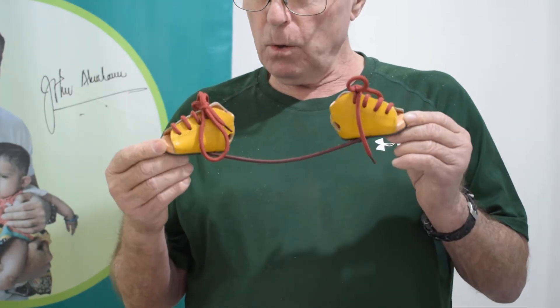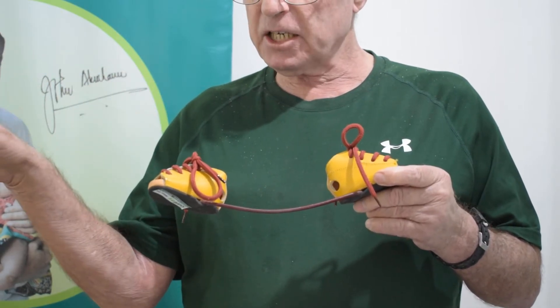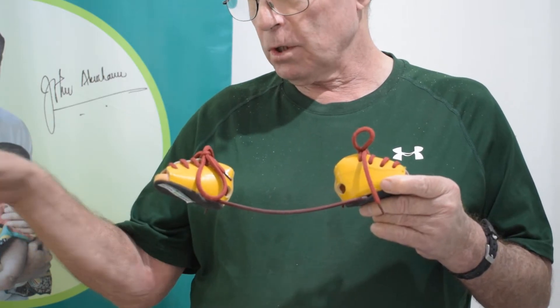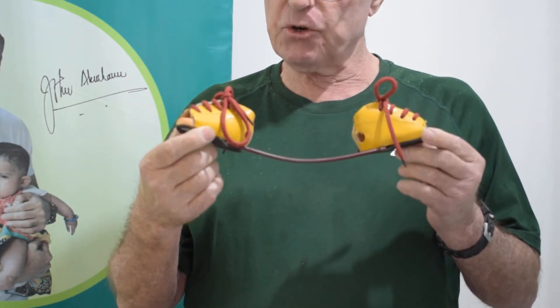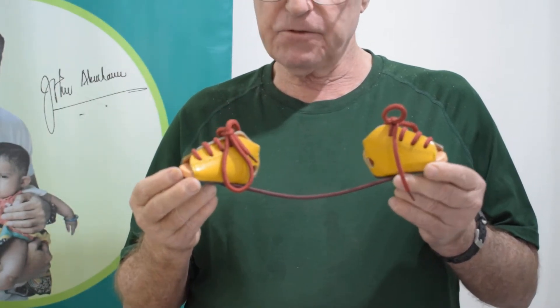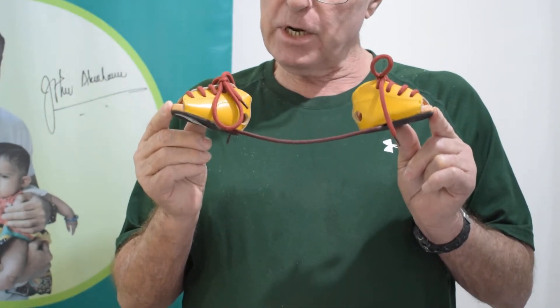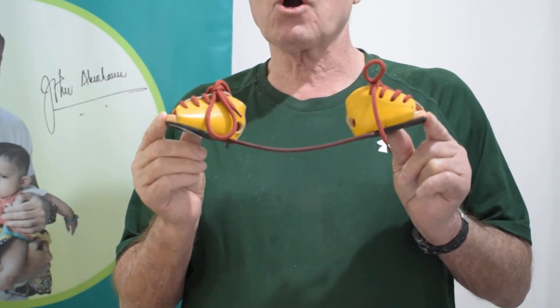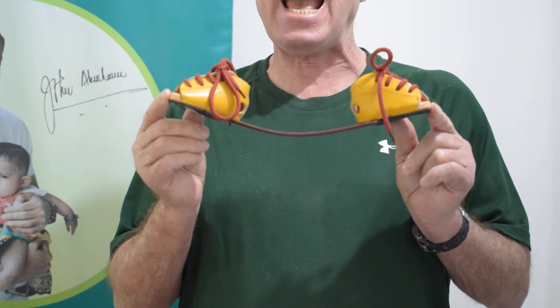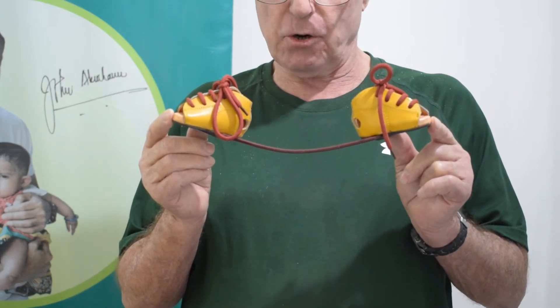What I'm holding here is known as a foot abduction brace, which abducts — meaning to push outward — the feet in 70 degrees of abduction and 10 degrees of dorsiflexion. This foot abduction brace is worn by children for a period of three to five years after the two months of cast corrections.